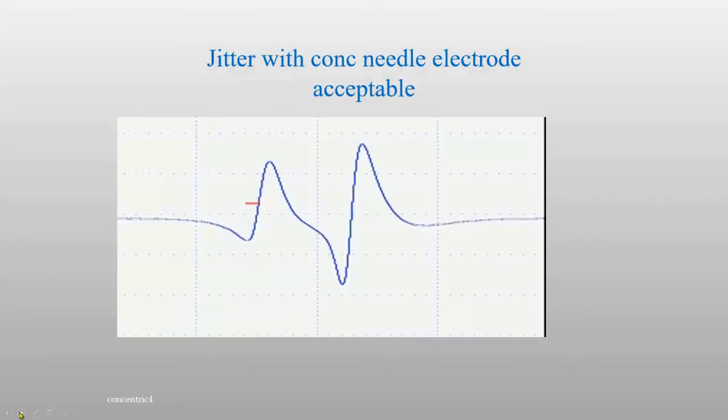And here's another recording with the concentric needle electrode when we are a little closer to the 2 muscle fibers, and we get a little more sharp signals.